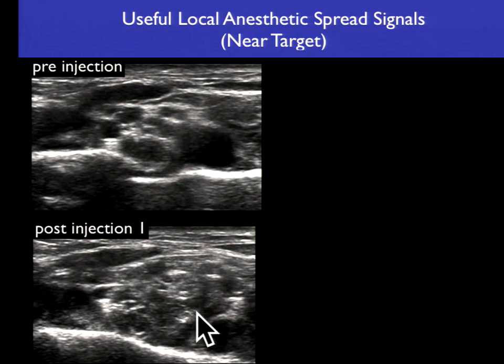This is one pattern that I see for supraclavicular. I showed you already, this whole compartment is swollen. So sometimes I worry this may be an intraneural injection, but I think you can see that is one of the trunks. This probably is another one.